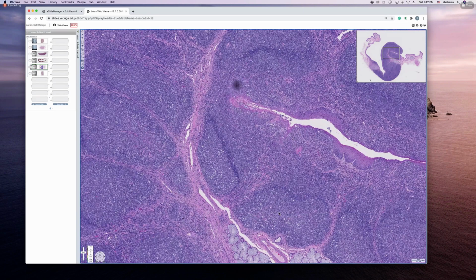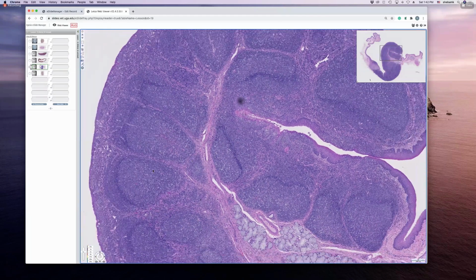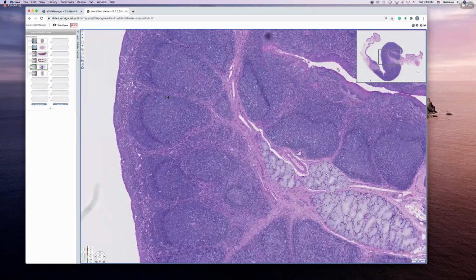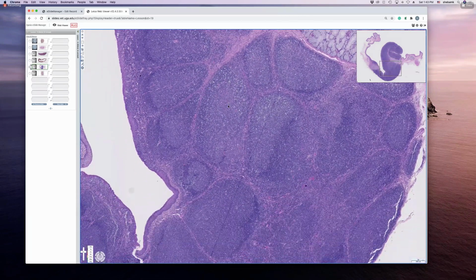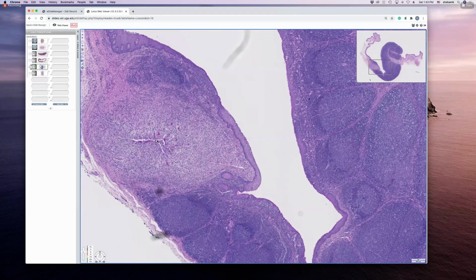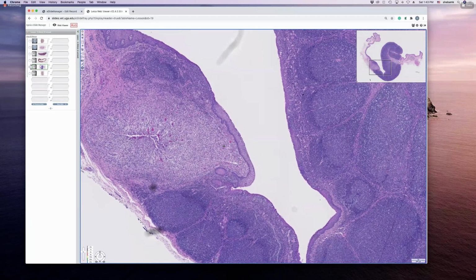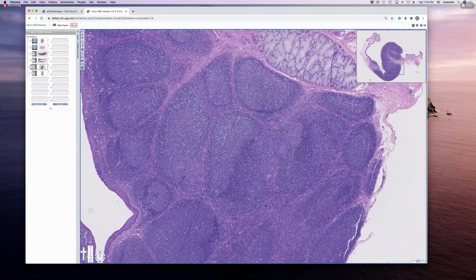So here you can see lymphoid follicles again. If you see these white spots, what does it mean? Are they macrophages? Yes, those are all macrophages that are sitting there. So this is a nice looking tonsil. And here there was another interesting thing that Dr. J pointed out. This is like a granuloma right here. You'll learn about that in pathology, but let's not worry about it right now. All these are lymphatic nodules associated with this tonsil.